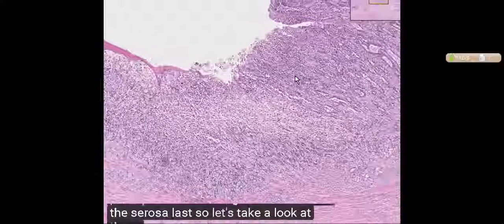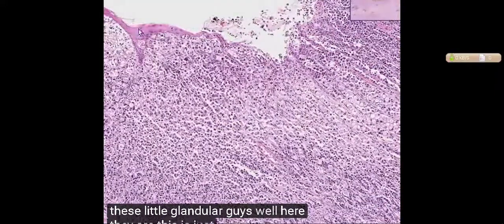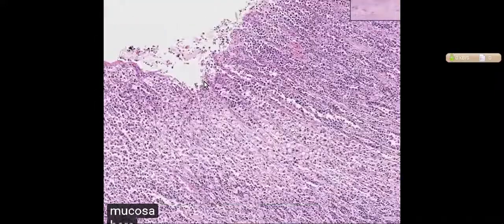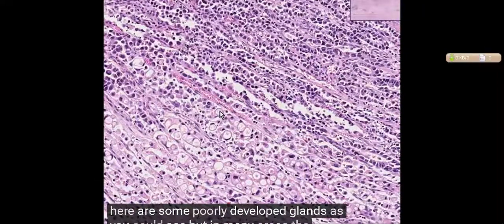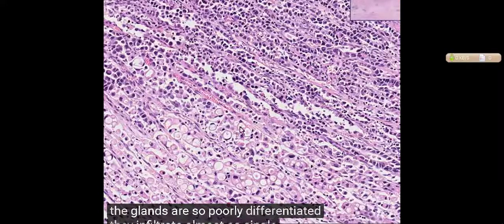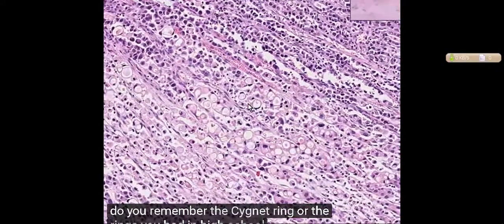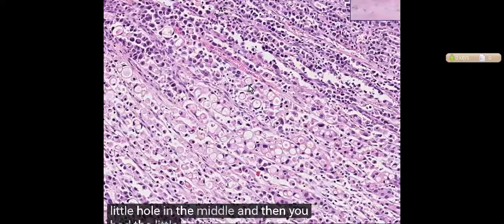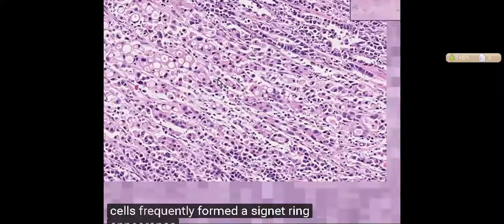So let's take a look at these little glandular guys. Well, here they are. This is just normal squamous mucosa. Here are some poorly developed glands, as you could see, but in many areas the glands are so poorly differentiated they infiltrate almost as single cells, like a ring. Do you remember the signet ring, or the rings you had in high school? You had a little hole in the middle, and then you had the little head of the ring on the top. Poorly differentiated adenocarcinoma cells frequently form this signet ring appearance.